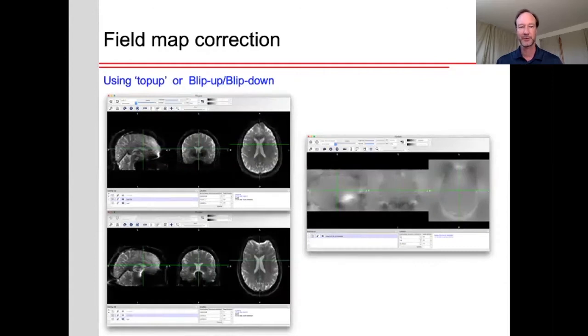Another technique to correct for distortions is to use what some people refer to as blip-up-blip-down, or the FSL program top-up correction. And that is if you acquire the data with an echo-planar imaging sequence scanning in one direction through k-space, some parts of the image might be stretched. If you flip that around and scan the other way through k-space, those same parts will be squished together. And so by comparing the images with these reverse phase encode directions, you can find out what parts of the brain have moved due to field distortions, and you can create a map of the field that way.